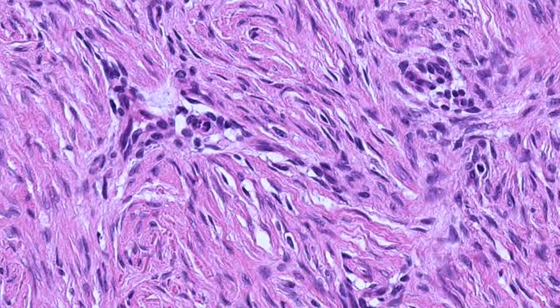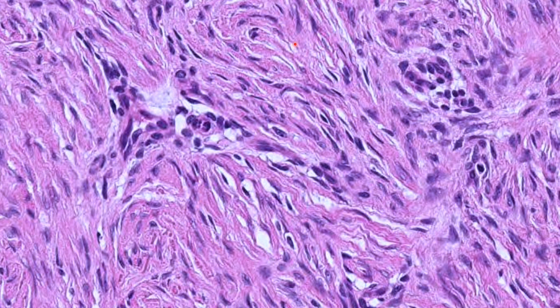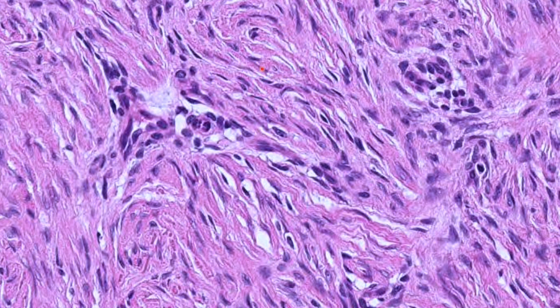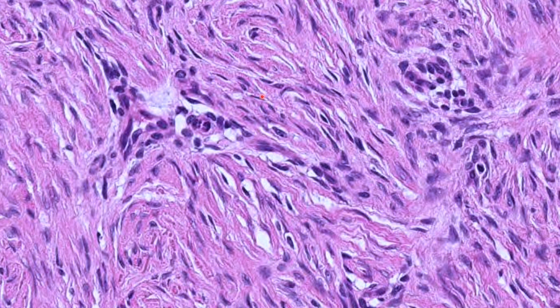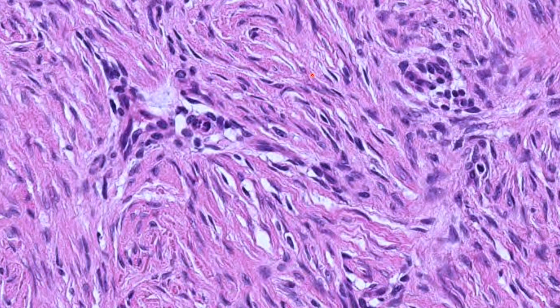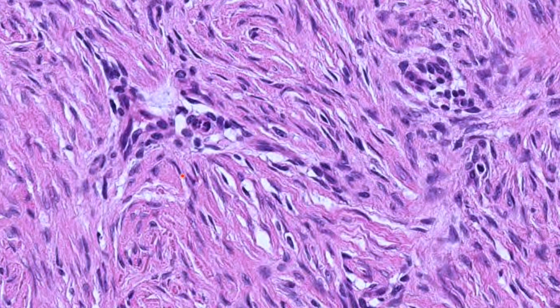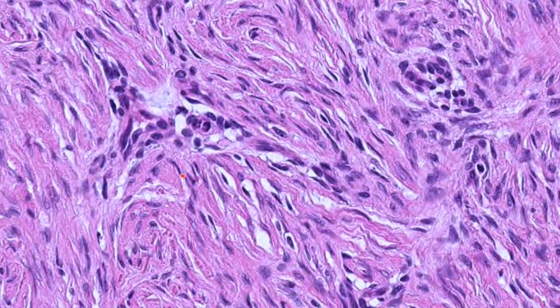Looking at this image — I'll tell you which tumor it's from later — most of you will agree these are spindle-shaped cells with elongated nuclei. When you look at these nuclei, they are very very thin, very slender nuclei. Sometimes it's very hard to find them. There's a good amount of pink cytoplasm, which is why the slide looks pink in color despite having so many cells. The nuclei are in the center or corner but very thin.